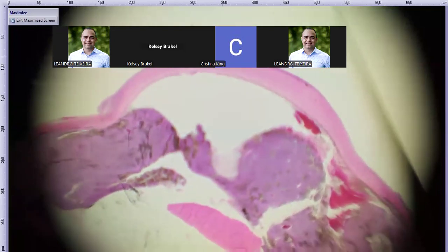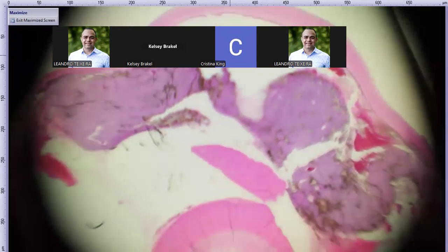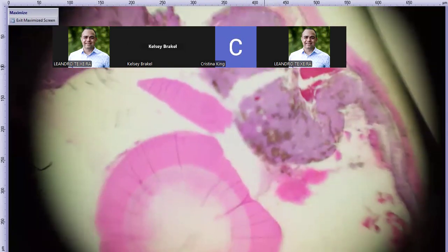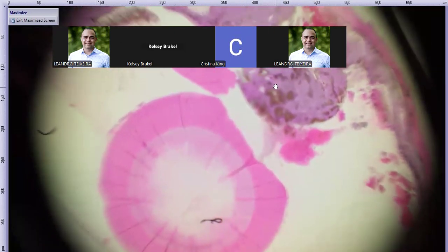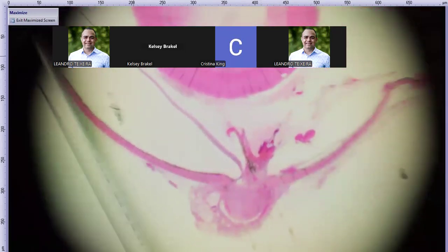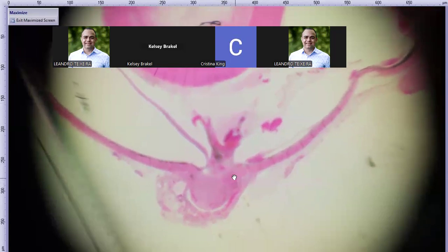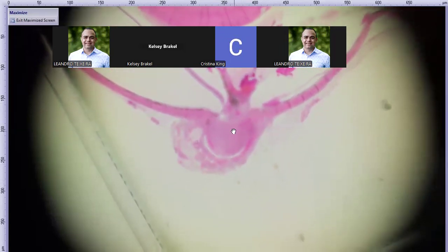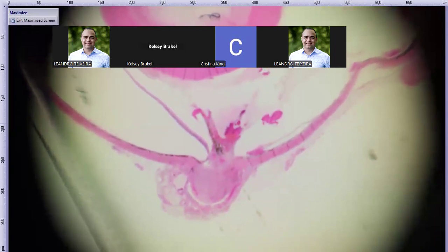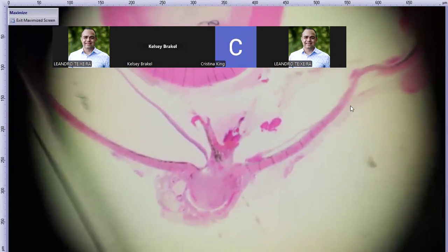Got cornea up here at the top, a little bit cellular here. Here's our thickened iris and ciliary body with a lot more cellular infiltrate in there and a lot of pigment as well. Our lens, our retina, you can see was detached, some membranes coming off of it.